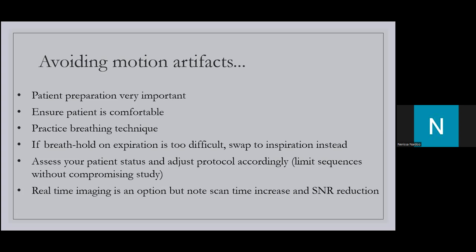What is the question that you are trying to answer? If you limit your sequences, can you still provide enough information without compromising the study? In that way, you are assisting your patient to get through an entire study, limiting time, limiting their discomfort, and you still have something to go on in terms of a treatment plan and a diagnosis. Again, real-time imaging is an option, but we must note that the scan time does increase, and then you have a subsequent reduction in your SNR.